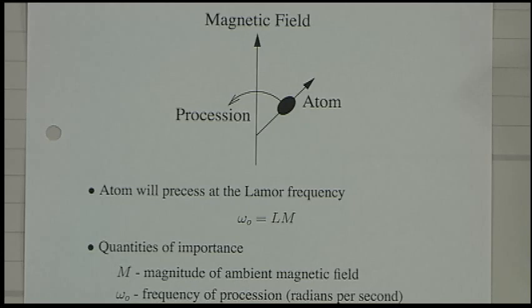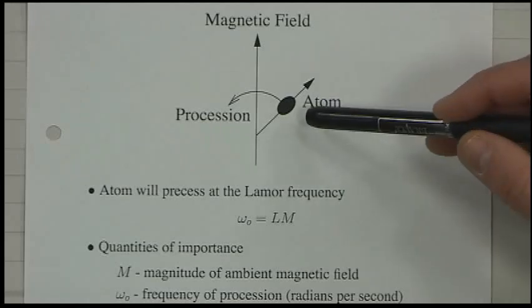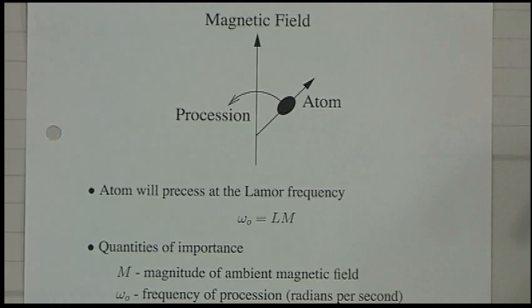If it bonds to oxygen, it forms water, and water is in a lot of biological tissue. So basically, humans are primarily composed of water in soft tissue. When you have a chemical reaction like that, it doesn't really change the nuclear properties.